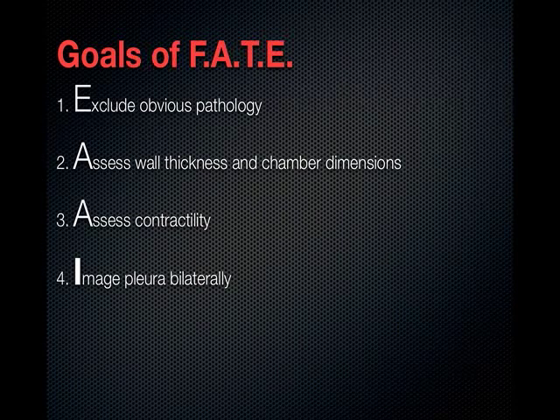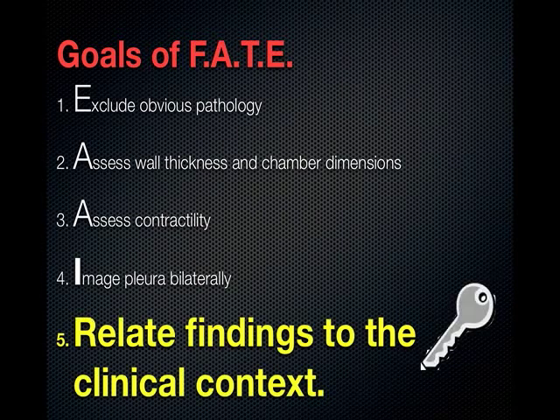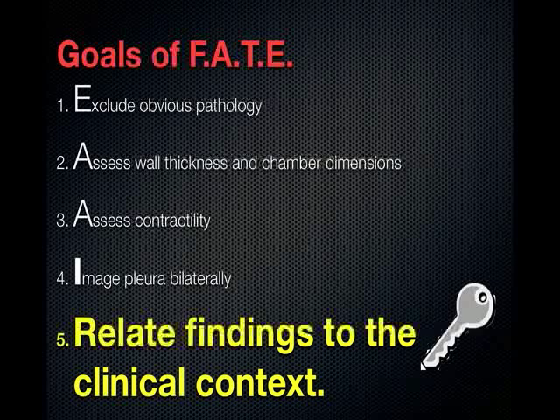But the most important goal of FATE is to relate the findings to the clinical context. Every time we approach a patient with point-of-care ultrasound, we should have a question in our mind. The question being anything from, why is this patient hypotensive? Why is this patient short of breath? Do they need more fluid? Do they need diuresis? We should always approach the patient with a question. And then when you get your images, you should relate the findings to the clinical context of that patient.